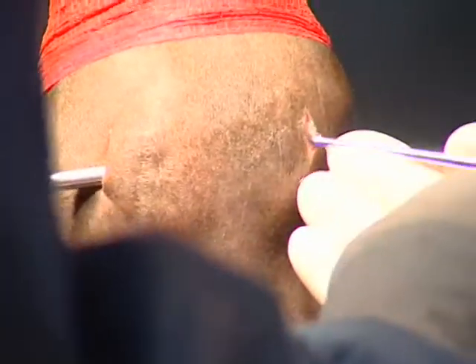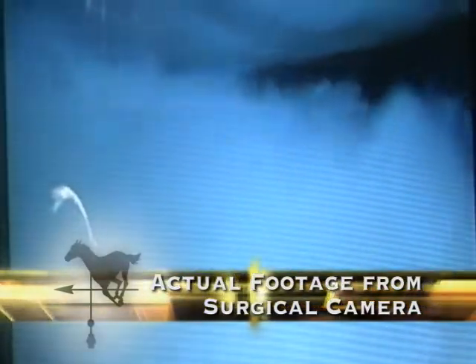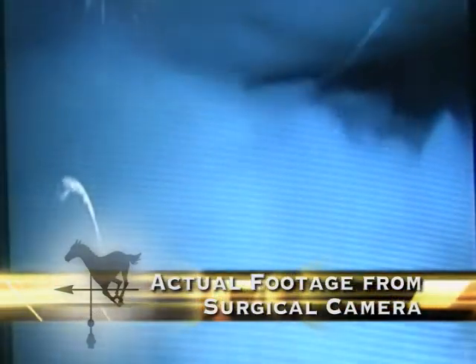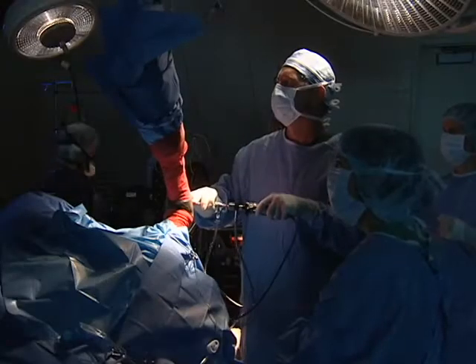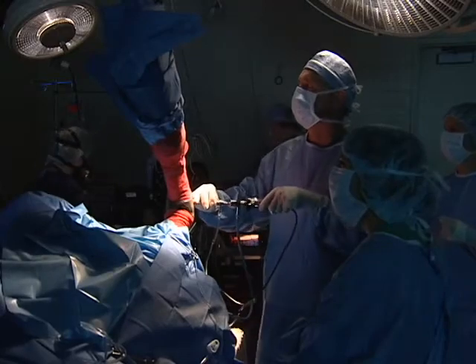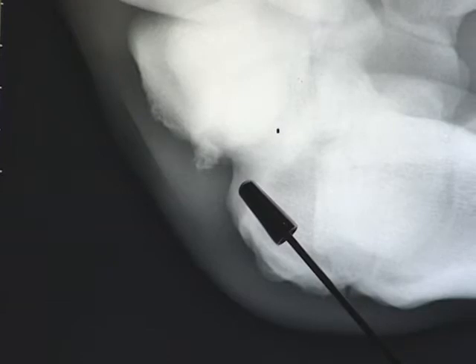Dr. Mike, tell us what we're seeing a little bit on the monitor there. What we're doing now, Dr. Eggleston's introduced his camera port, and there's fluid being injected into the joint and extending it. And you'll see a few air bubbles floating around. There's one right there. That's just air coming through the line. And he's trying to look through and see if he can isolate the areas of pathology in this joint. So what we saw in the radiographs, he's looking for that now in real life. He's trying to correlate the radiographic findings with what he's seeing.